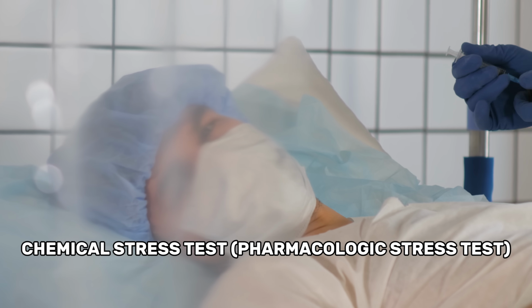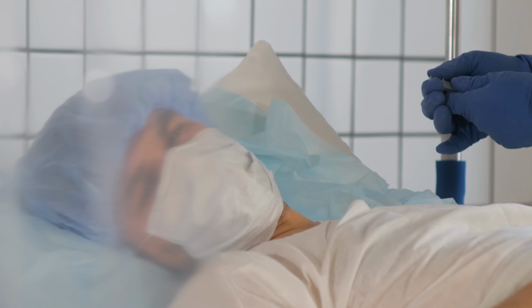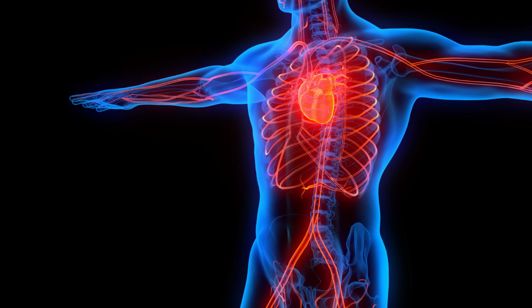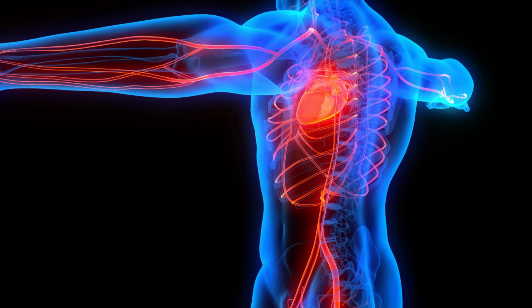Okay. Patients lie flat on a table. Here we just give them an injection of something over 4 minutes, and it opens up the arteries of the heart. If there happens to be a blocked artery there, it doesn't open as well as the others. It causes something called coronary steal. And with some imaging, we have to have imaging with that. Right. With some imaging, we can detect whether or not the person that can't exercise actually has a blocked artery.